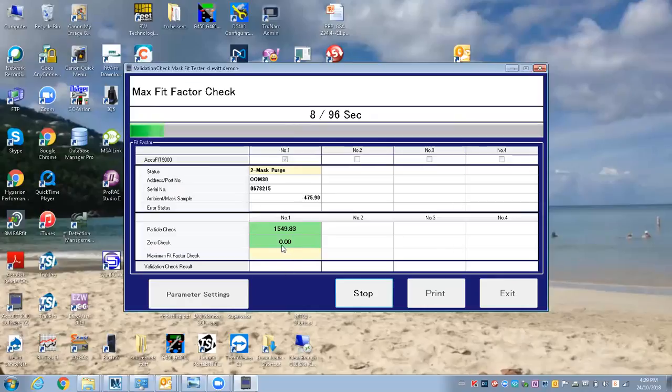There might be an issue with the tubing or it's leaked somewhere. If there was a leak, we'd have a problem with the zero check. Before you get a bunch of people waiting to do fit tests, you want to run through this.